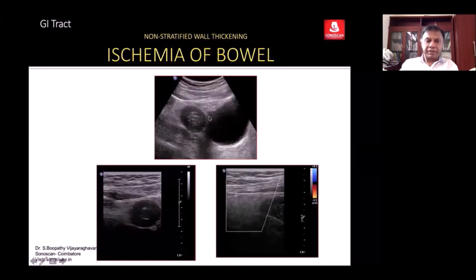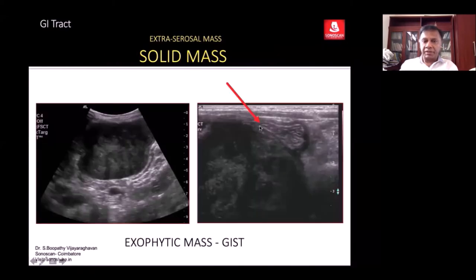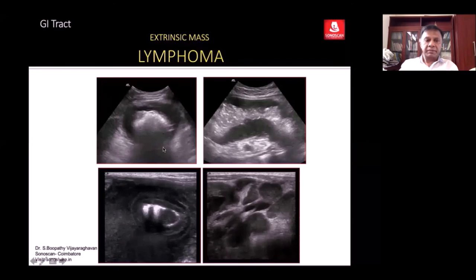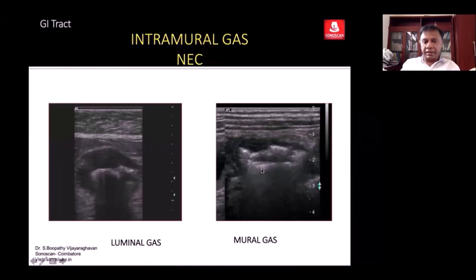Non-stratified thickening of the bowel in high frequency. You see the mesentery — thick and echogenic — with the adjacent bowel showing the bowel signature. When you see the wall, a mass is present. This is the typical appearance of lymphoma: non-stratified thickening of the bowel giving the pseudokidney appearance on long axis scan. In contrast, you see the thick wall of the bowel.